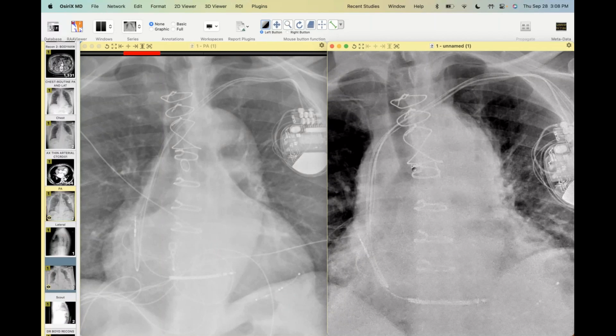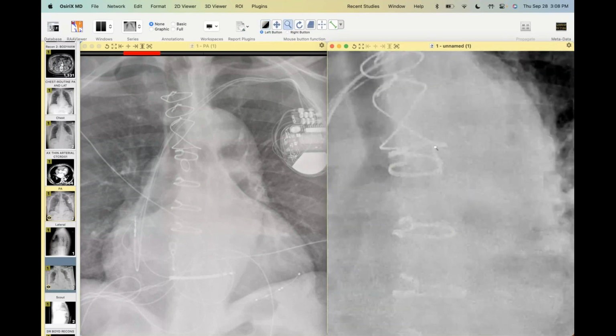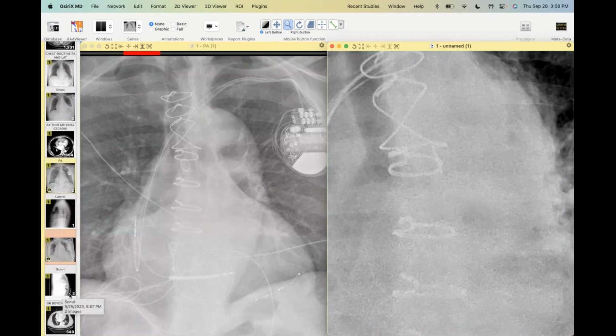But notice the ostial marker was right there, and this is it right here. It was vertical before, but it's changed its orientation, where you're seeing it in profile rather than oblique or en face. And this patient had been having recent worsening fever, B symptoms, and had developed chest pain.